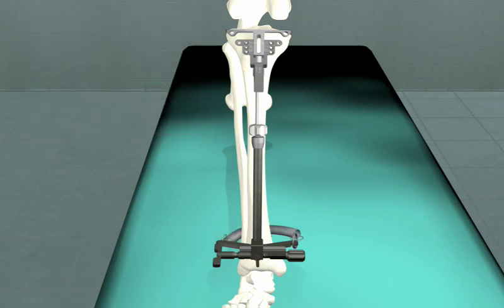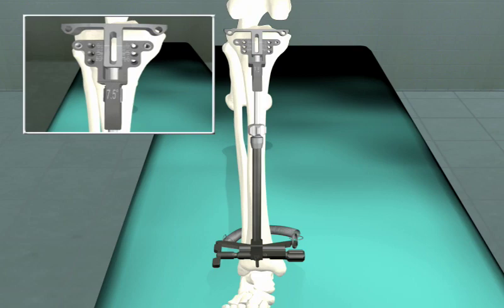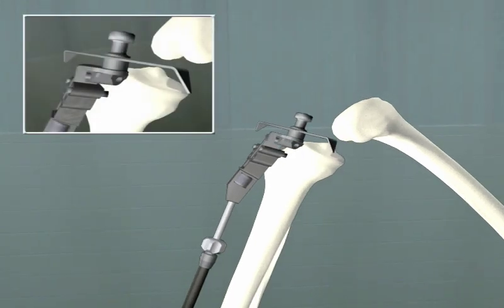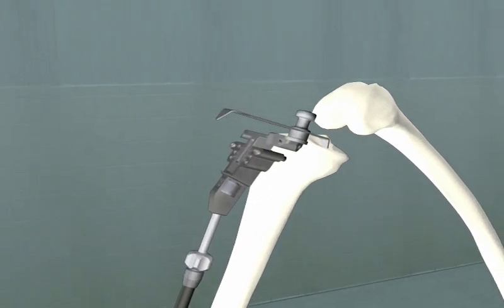Once the strap is connected, the proximal portion of the guide can be raised or lowered using the alignment rod, and the guide should be placed in the frontal plane to be perpendicular to the frontal plane axis. The resection caliper guide can be placed on the upper portion of the guide to find the lowest point of resection, and this can be adjusted depending on the pathology encountered.